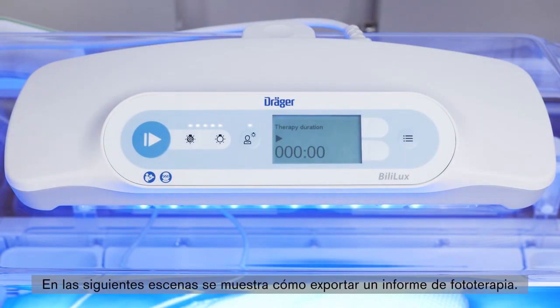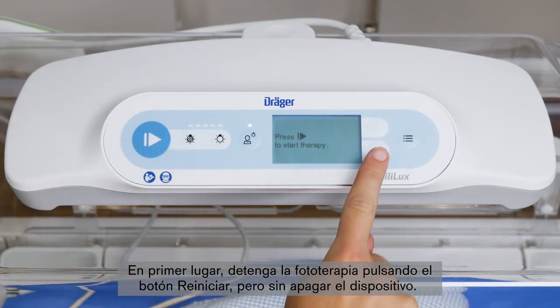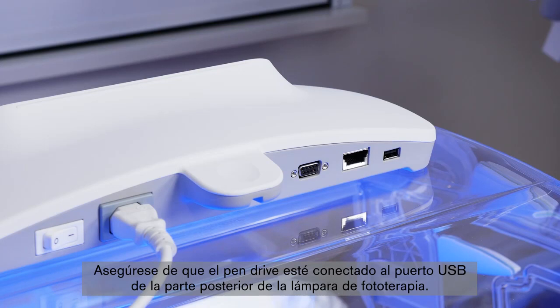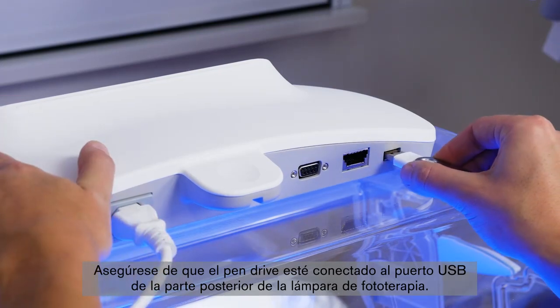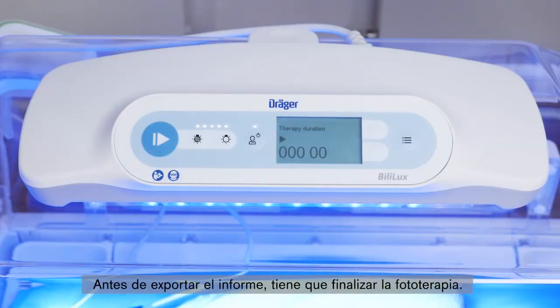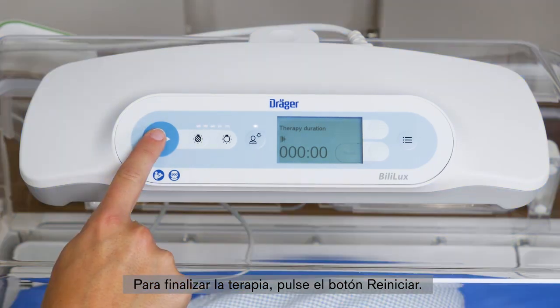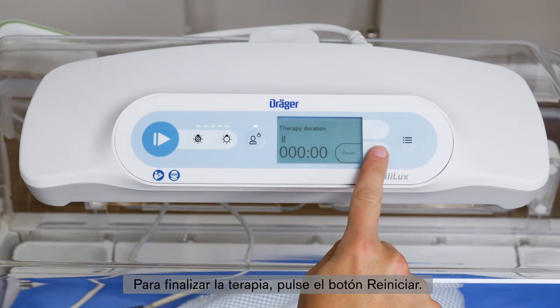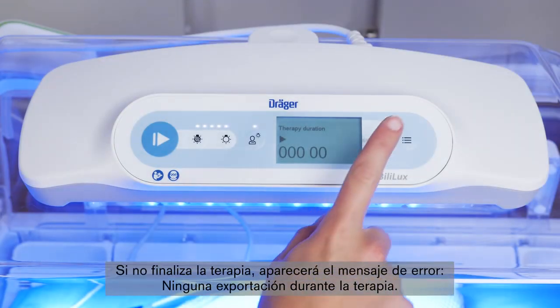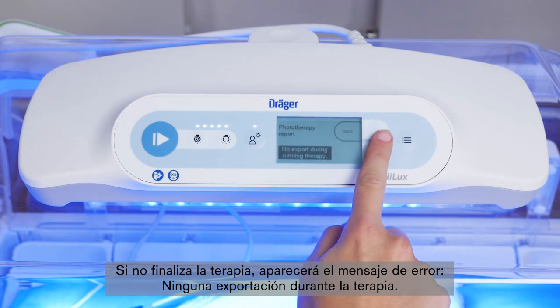In the following scenes, we will show you how to export a phototherapy report. First, stop phototherapy by pushing the reset button, but do not switch off the device. Ensure that the USB flash drive is connected to the USB port on the rear of the phototherapy light. Before you can export the report, you have to end the phototherapy. Go to the phototherapy screen and pause the phototherapy, then press the reset button to end the therapy. If you do not end the therapy, you will get an error message: 'No export during running therapy.'